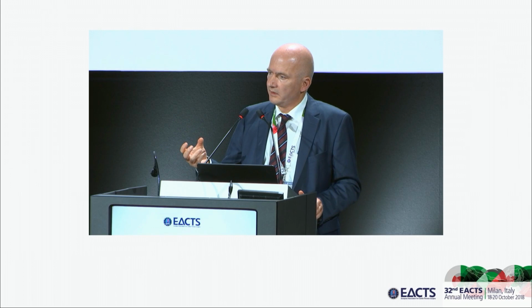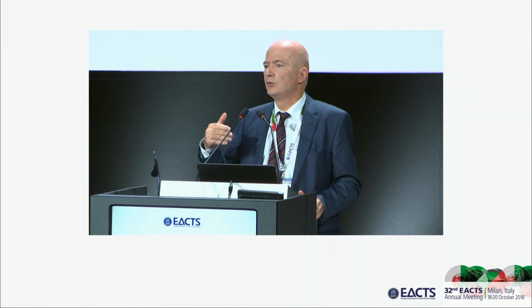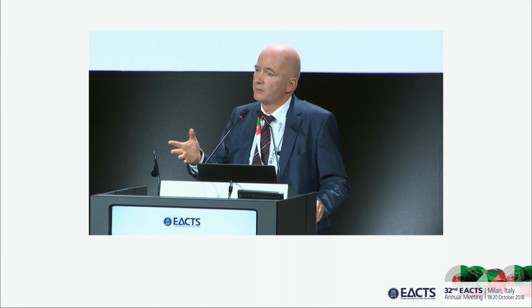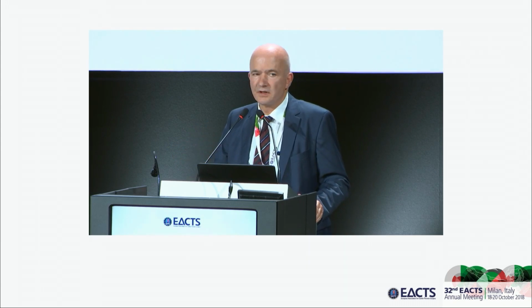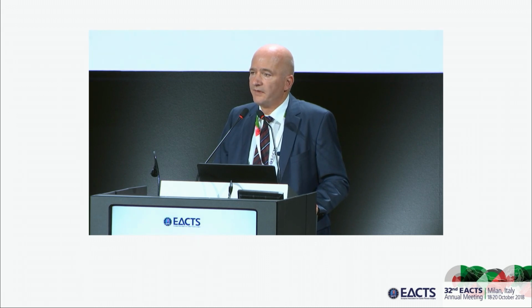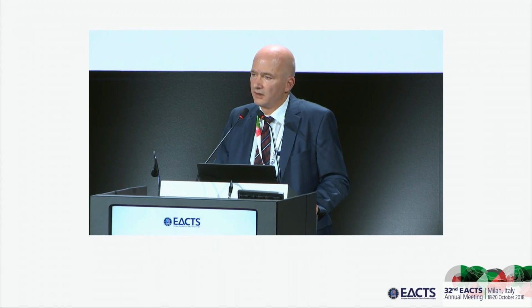Now, these dynamic changes we can assess much better using 3D echo than with a CT, unless we do an EKG-gated cardiac CT scan, where we use radiation throughout the whole cycle, and then radiation exposure becomes relevant. So, in effect, I think 3D echo, and this is why I was very happy to hear Michel with the first lecture before the break, 3D echo, I think, is probably the best tool that we can use for imaging and decision-making.